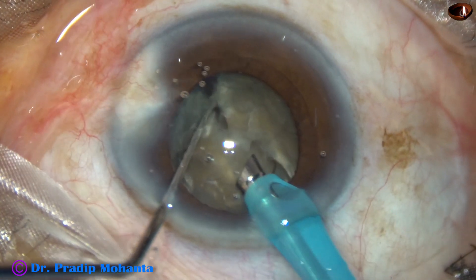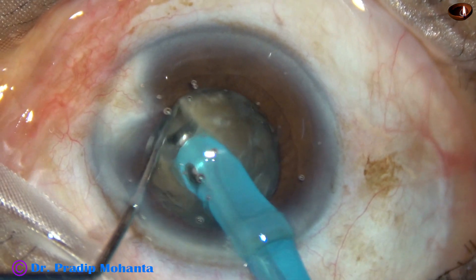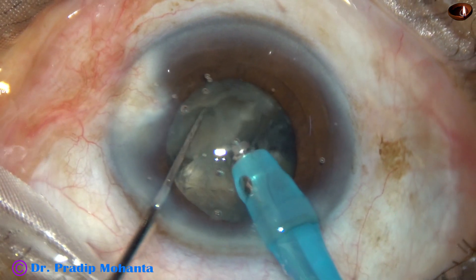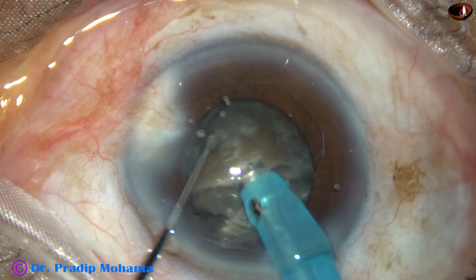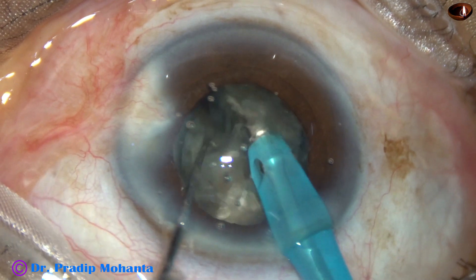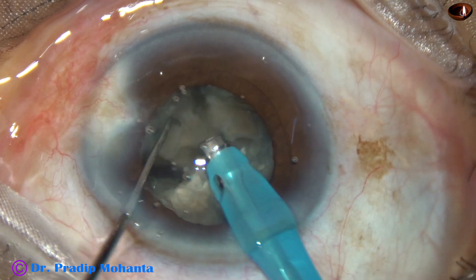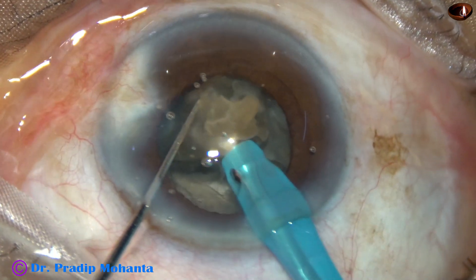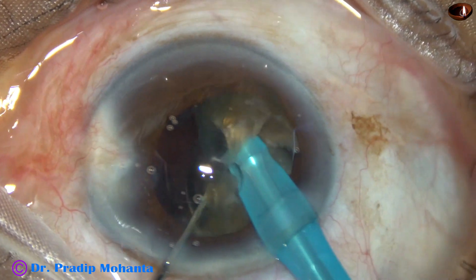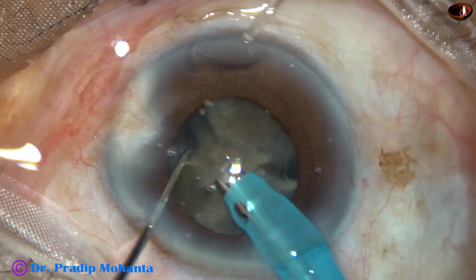The nucleus is rotated 180 degrees and the two heminuclei are completely separated from each other. See how quickly we have divided the nucleus into two heminuclei. Each heminucleus is subdivided into two big pieces. In this case, I manage these two pieces from the first heminucleus first. This piece has been subdivided into two smaller pieces, and it is being emulsified and removed.